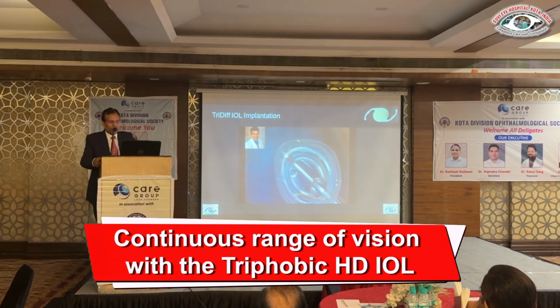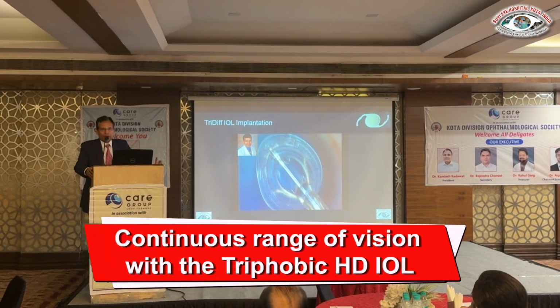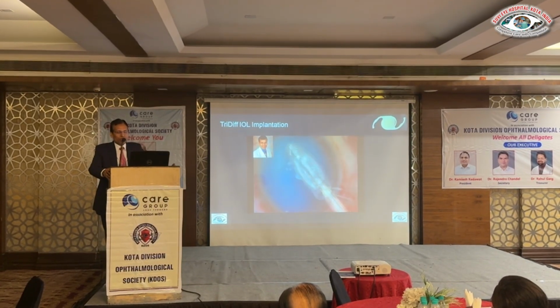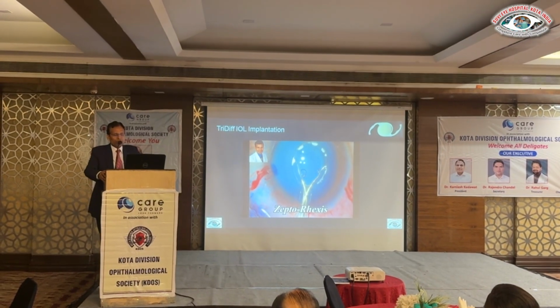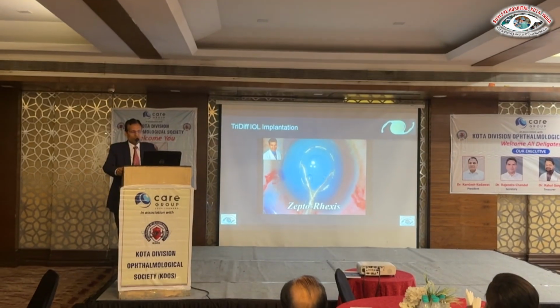So this device, which is Zepto nanopulse technology, can be helpful to achieve the perfect capsulorhexis in cases of white intumescent cataract. So you can see this is the device with the silicone cup being inserted using a 2.8 mm incision, and once you use the vacuum with the nitinol ring, this achieves a perfect capsulorhexis within a few seconds.